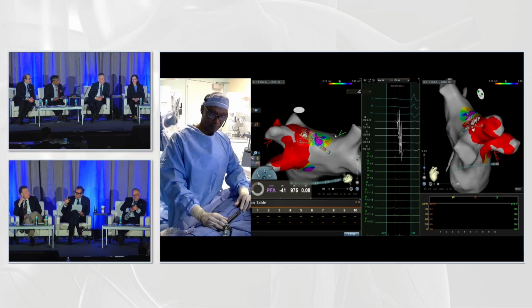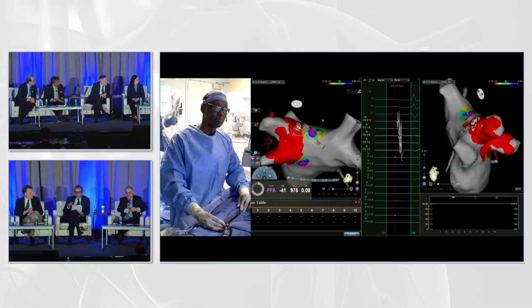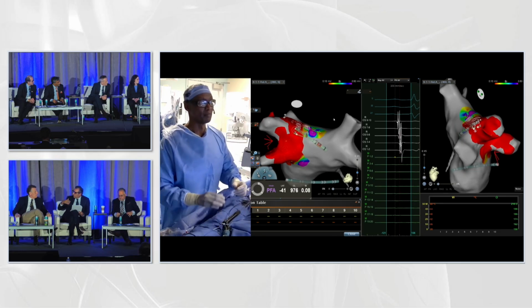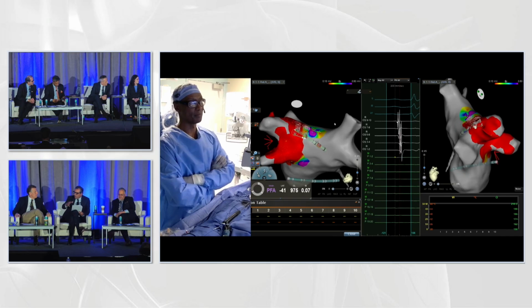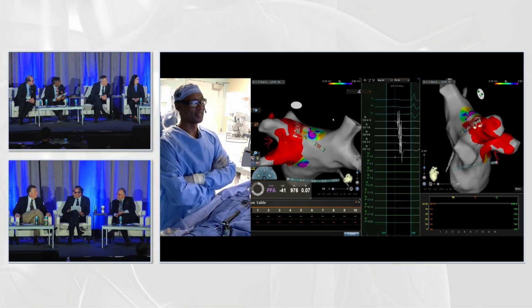And I would say something to people who use the Varipulse, especially the users who are used to the Farapulse: don't expect the same. With Farapulse, we do a lot of lesions safely. And then you try to convert this in your mind to this catheter, which is not the case. This catheter, in my opinion, you don't need to do that amount of lesions to achieve the same goals. I think there's data coming out in terms of MRIs and follow-up. So keep this in mind.